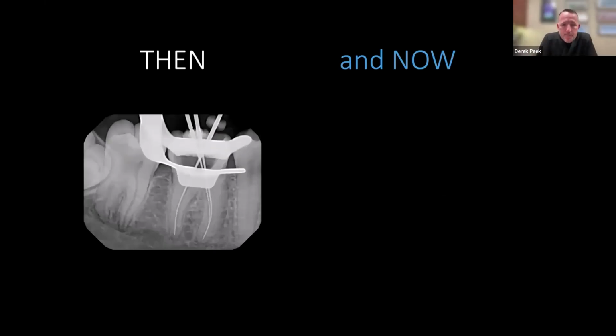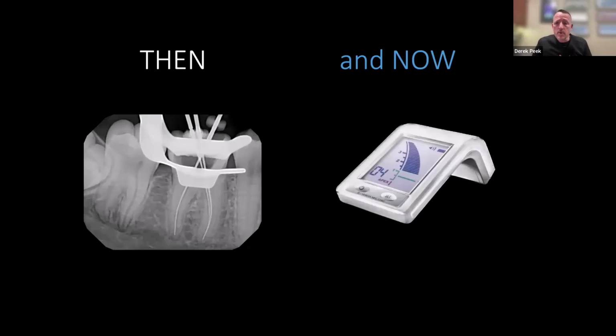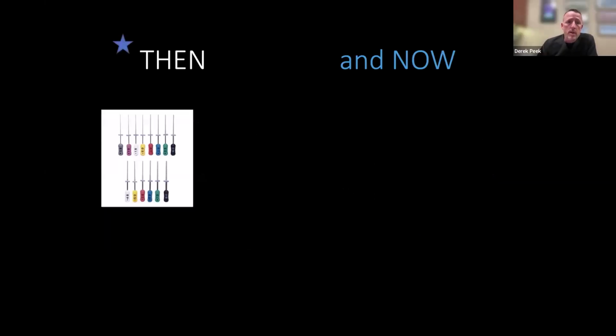And with my dad, I was still amazed towards the end of his career. He'd be getting working length and I'd hear it buzz and I'd come in and check the x-ray, and he could pretty much get working length every time right on the apex without an apex locator. I'm pretty much bound to my locator because it makes it that much easier and quicker. If I had to do it by feel, I think I need another 10, 20,000 cases in me before my fingers start feeling it. But I think I'm getting there. It just goes to show there is some talent, some tactile feedback to what we do, and it does play a part in it.